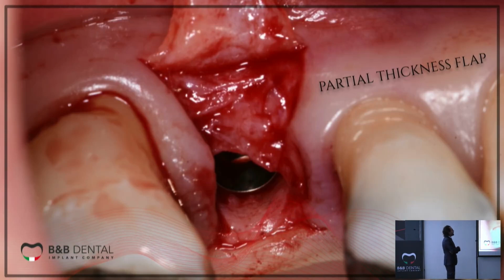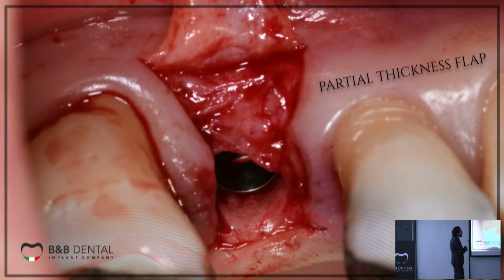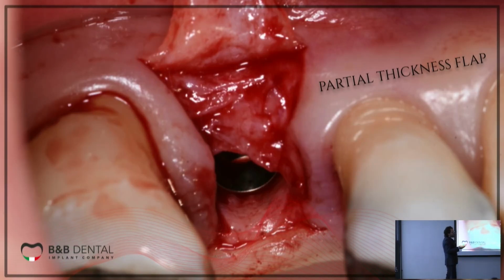In my opinion, this is the best approach because we can maintain the periosteum, and that is very important when we split the ridge. We can fracture the bone wall. This is not going to be a big problem if we still have the periosteum on site. On the contrary, it's going to be a problem if we raise a full thickness flap.